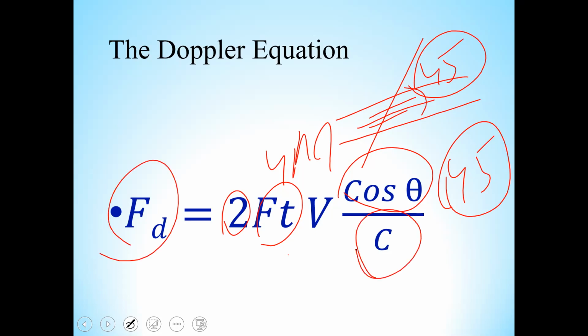And c is constant in the soft tissue, and that is 1540 meters per second, and different for different tissues. So that is also constant, and kept as a calibration speed by the ultrasound machine as well.